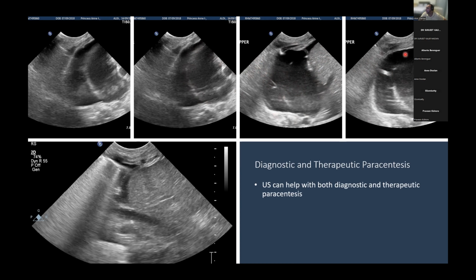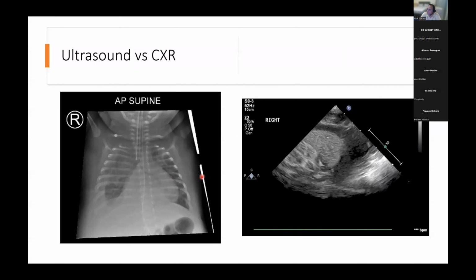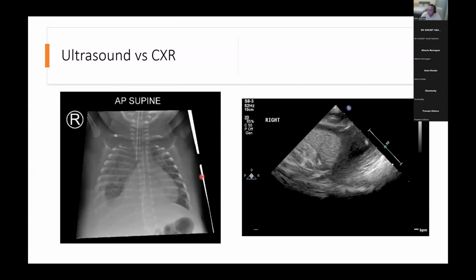And you can see that actually the lung margin, the visceral pleura, is coming adjacent to the parietal pleura. Really, what you can see is this margin here. You can just about see the needle at that particular point. I can't see the needle here. But then after that, you get really close. And what you want to make sure is that you don't reach this situation, because the needle is going to puncture the lung. And if that is the case, what can happen in situations like that is you can end up with a pneumothorax.